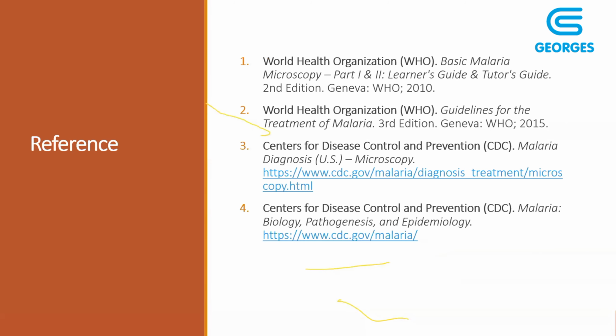We have the first question here, from Evelyn. Evelyn is asking, why is it important to mention gametocytes to the clinicians? So, I can tackle that. It is very important to mention gametocytes to the clinician because the very first reason is that it means that malaria is there. It means that that person has malaria. So failing to mention it is not okay, because clinicians need that information to know that this person has malaria.